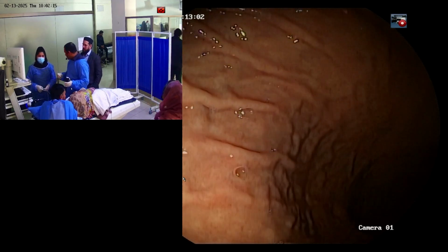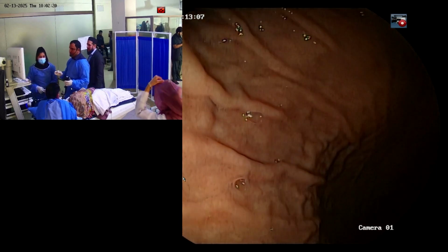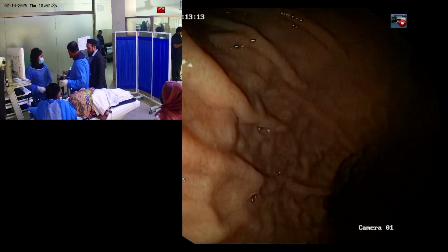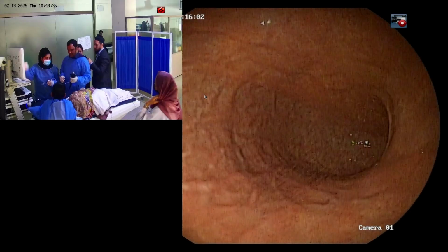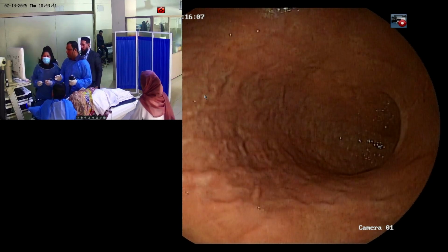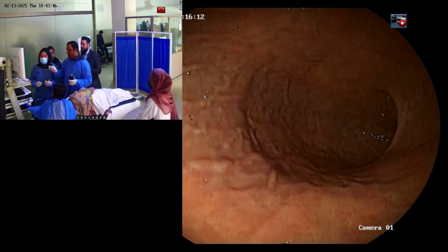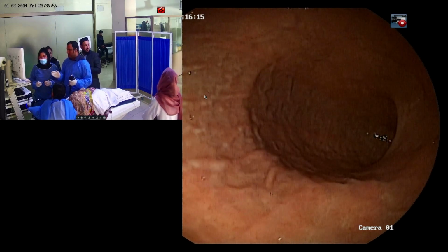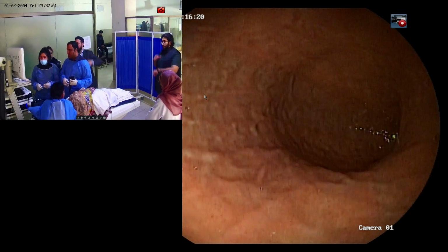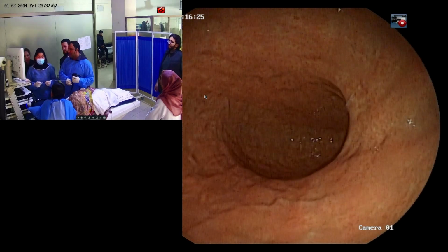And for pushing purposes, we should always have extra needles. We should always have extra histoacryl, because there may be continued bleeding and we may need to re-inject. So we did a drill. I told her to prepare the multiple injections, fill them with histoacryl, and then the pusher for pushing purposes. For pushing, the solution to be used is distilled water, not normal saline, because normal saline accelerates the polymerization of histoacryl. And then we are putting it in.